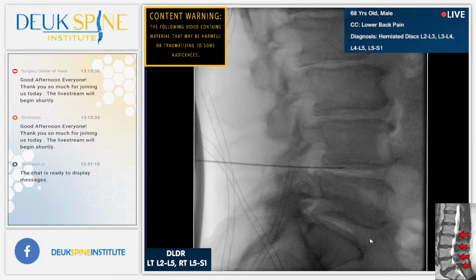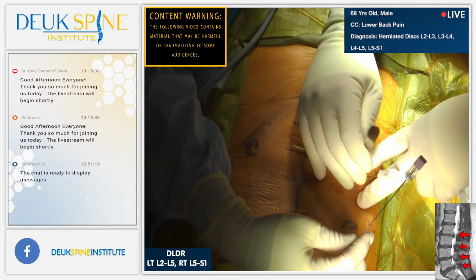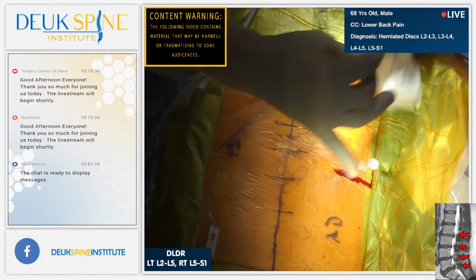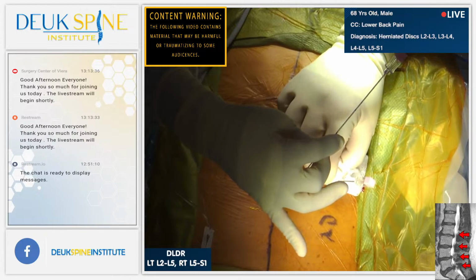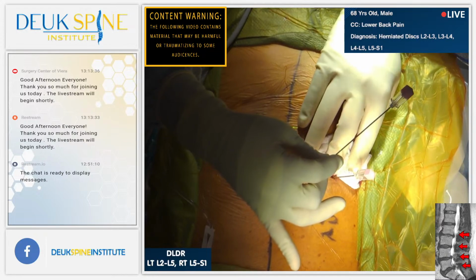It's called vacuum space phenomena. Henry, are you able to see it? The white arrow? Yes, we can. That's at L5-S1. There's also one happening at L4-5, right there. Vacuum space phenomena, folks, is air, not even air, it's space, actually, the lack of air inside the middle of a disc. And it happens when there's a negative pressure, and somehow it manages to get some gas in there, nobody really knows the exact mechanism. But that gas, of course, is sucked into the disc space because there's so much negative pressure, and that comes from degenerative disc disease.